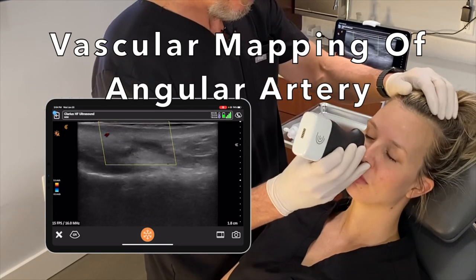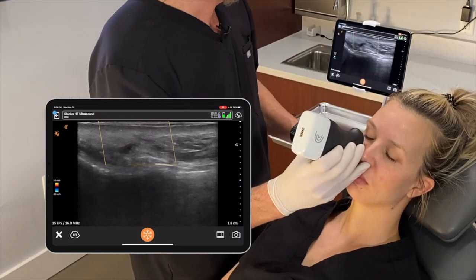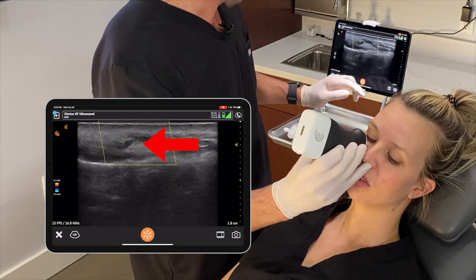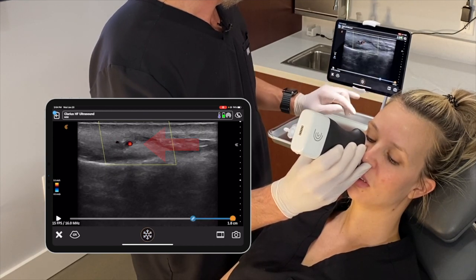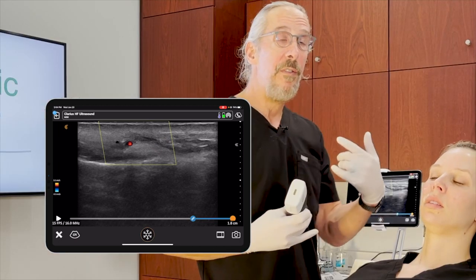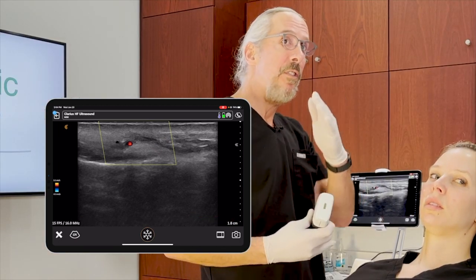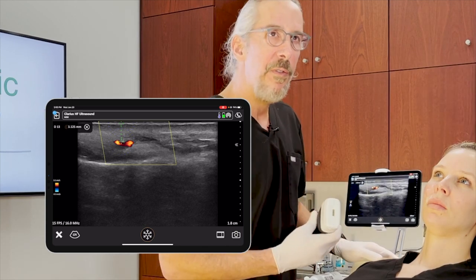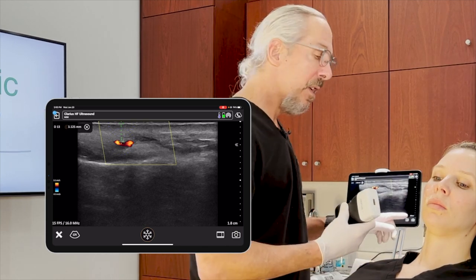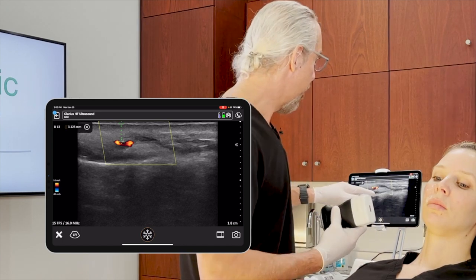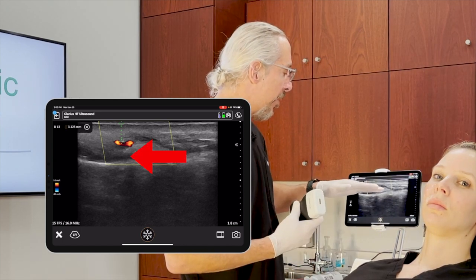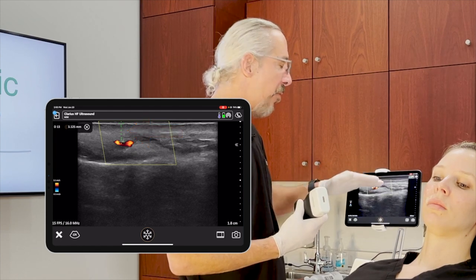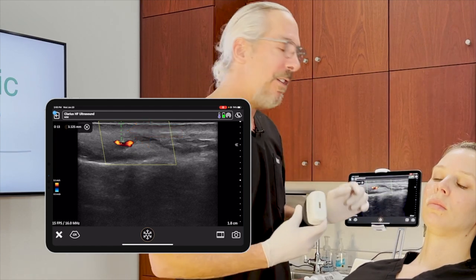This is one of the more common vessels that is injected and causes vascular occlusion. Here's a cross-section of the angular artery, which is a continuation of the facial artery after it gives a branch of the superior labial artery. In this area it measures about 3.125 millimeters deep, so that's pretty superficial. There's a plane below and a plane above for your injection — you just don't want to be in the middle where that vessel is.